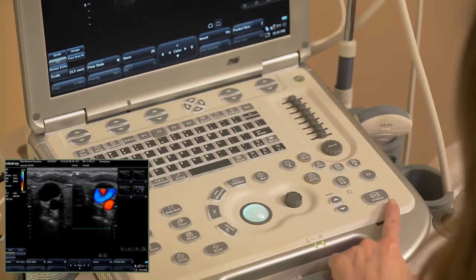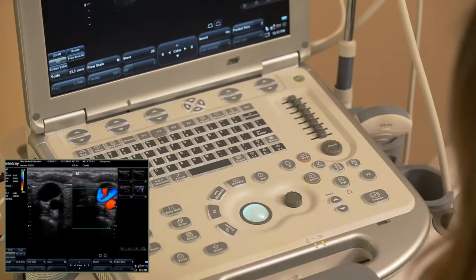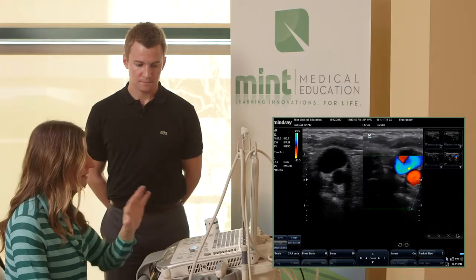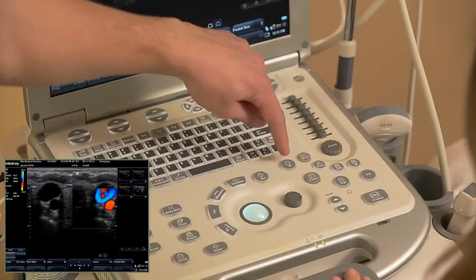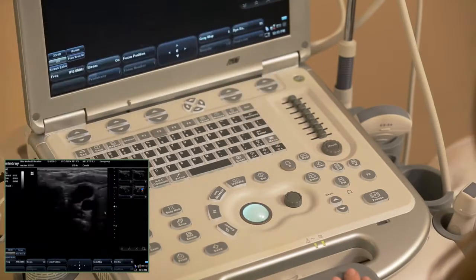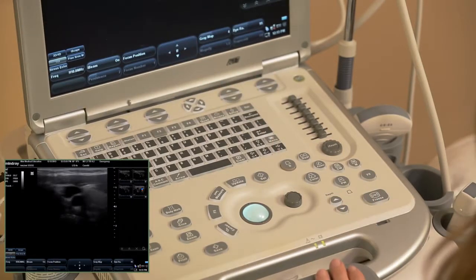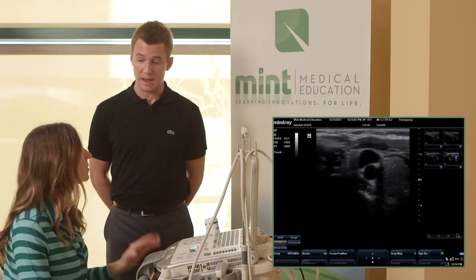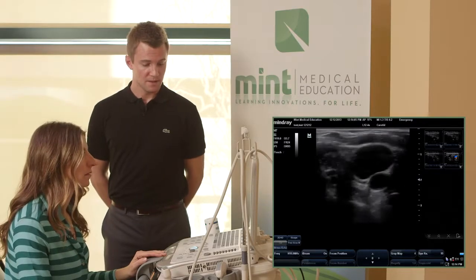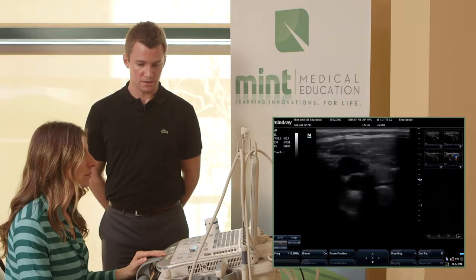So do you have a way to easily get back to, is there one button I could hit to get me out of color, out of dual, everything? Yes, there is. So you'll see that when you press B, that brings you back just to home, regular old ultrasound without any modes on. Because sometimes you might have accidentally pressed a couple of those buttons and not sure how to get back out of it. And B mode's the best bet to bring you back to a good old home screen there.